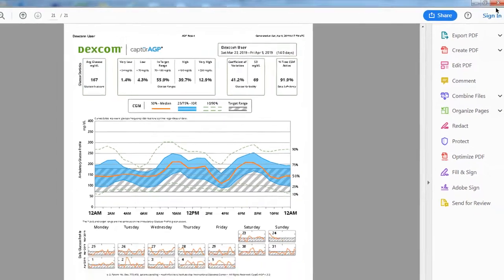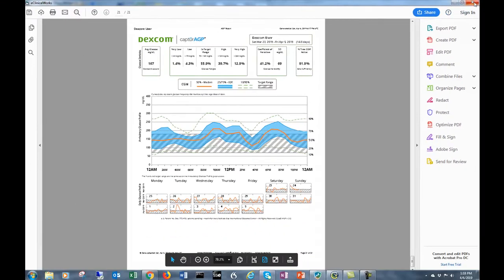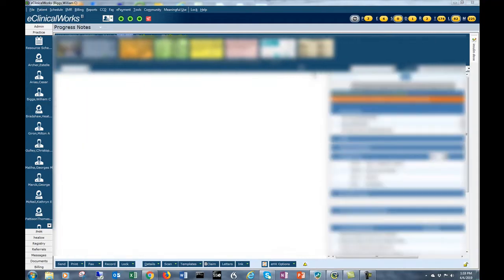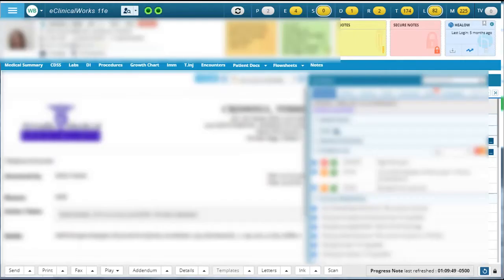So that's all there is. You can then back out and go back to the progress note, click out of the Helo Hub and you're back where you started. Let's try the same thing in the Chrome version.